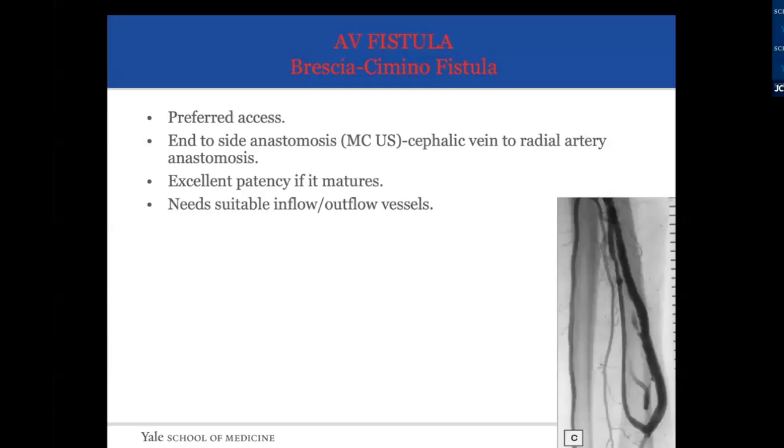So over the period of the past 5 years, we have been changing from fistula first, creating a fistula for patients, to peritoneal dialysis catheter. And the reason for that is because we're trying to save veins as much as we can.